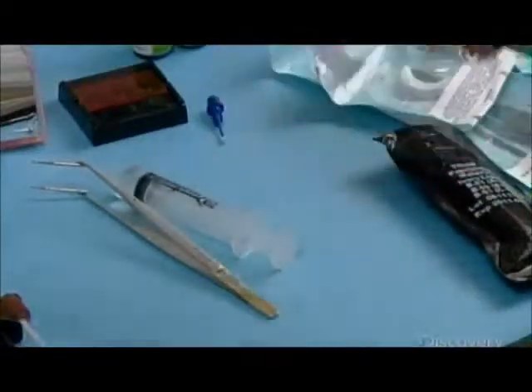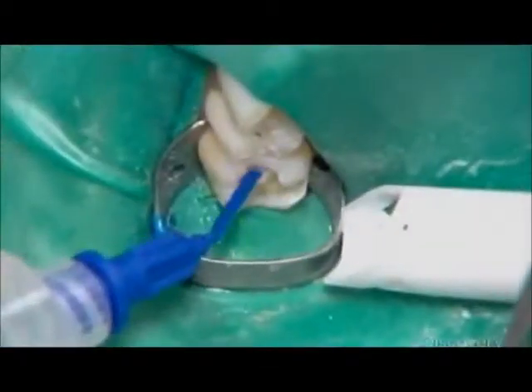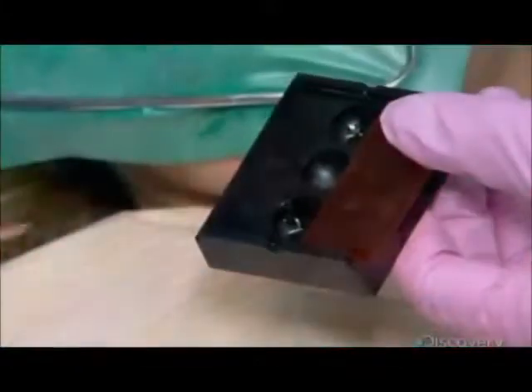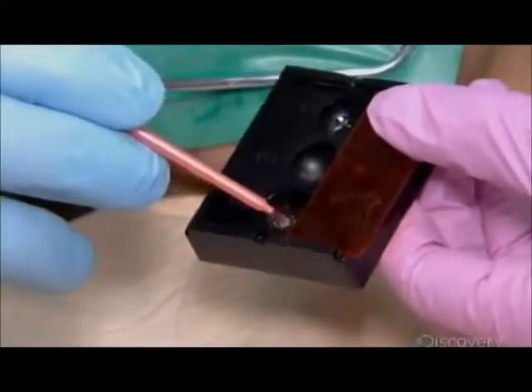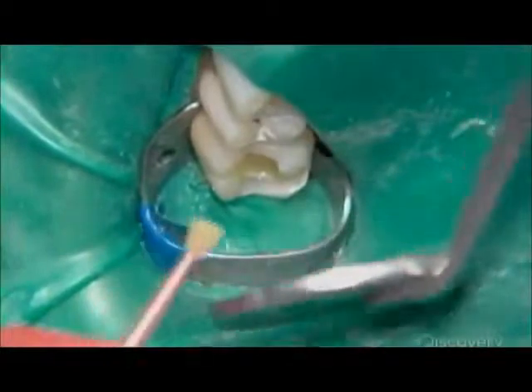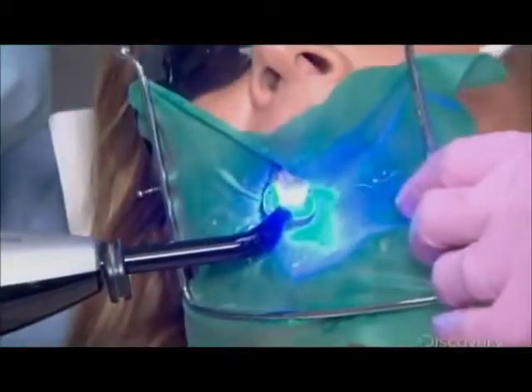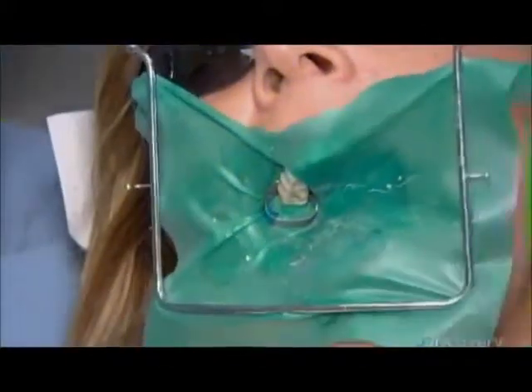The dental assistant then scrubs an antimicrobial solution into the tooth. Then she brushes an acidic conditioner into the cavity. The dentist activates the conditioner with a halogen light.